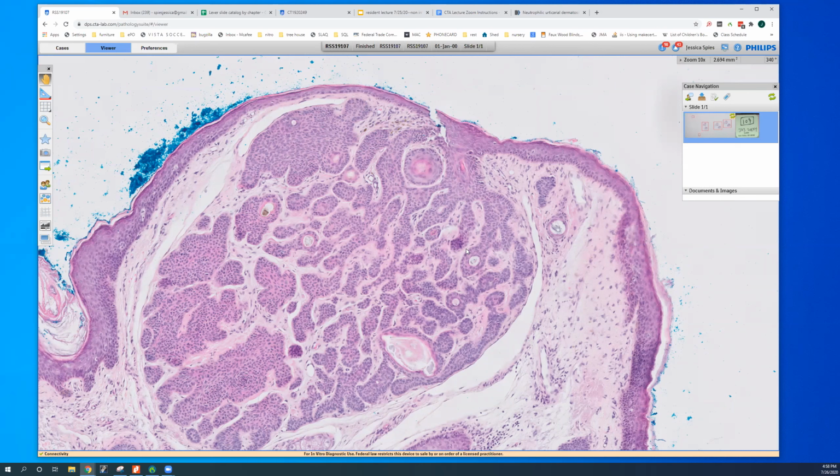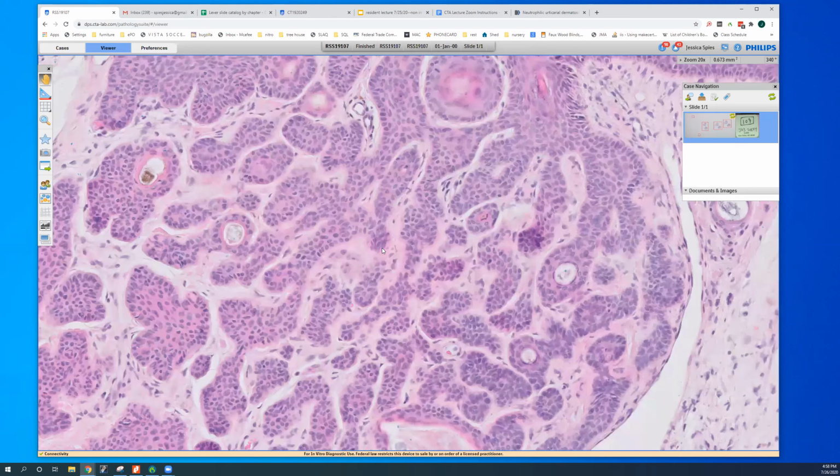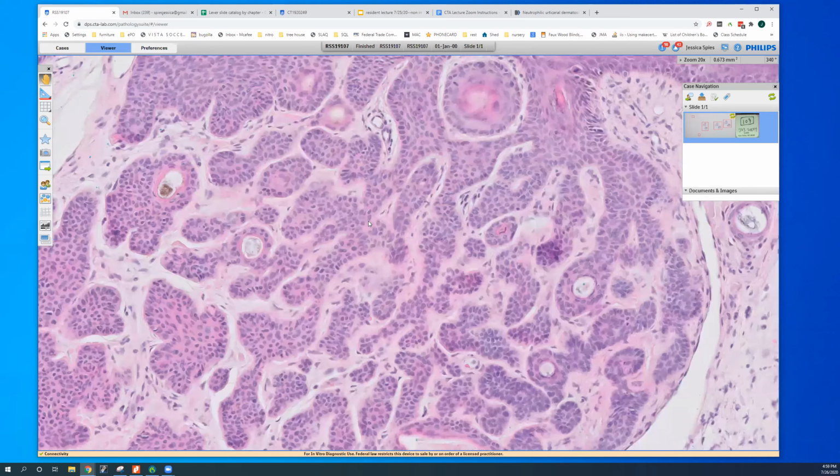SCAP is a thought. Syringocystadenoma papilliferum. Yeah, it would be in the differential diagnosis. That you tend to see invaginations, more elongated duct formation, and often lots of plasma cells in the stroma. Yeah, cylindroma has two types. Yeah, this is all one cell type. Yeah.